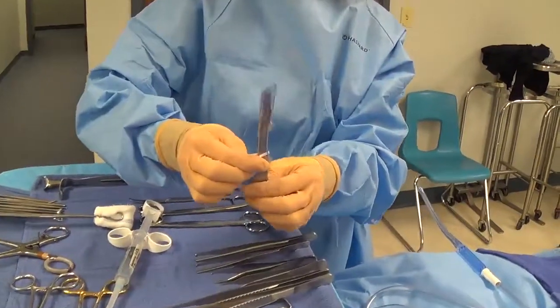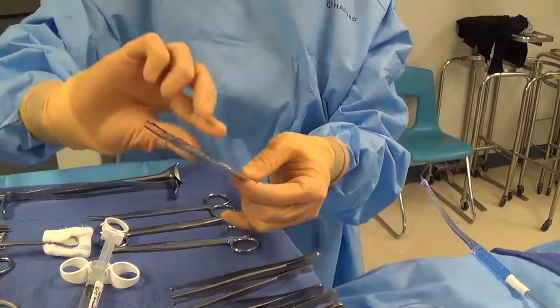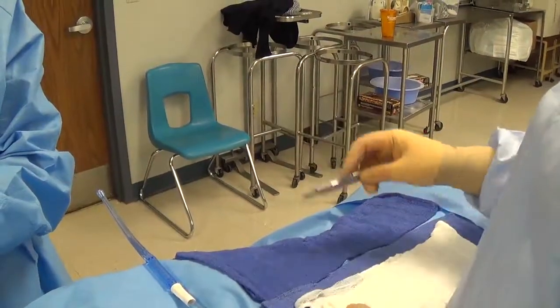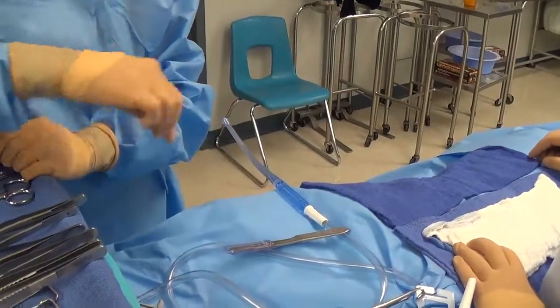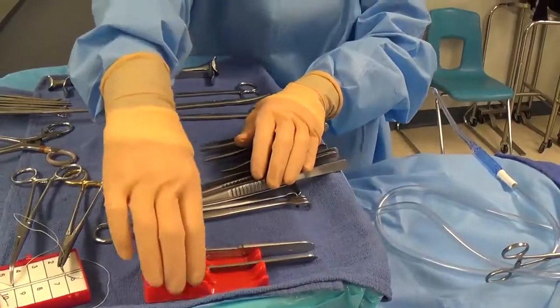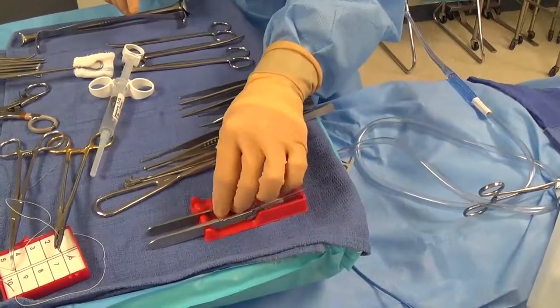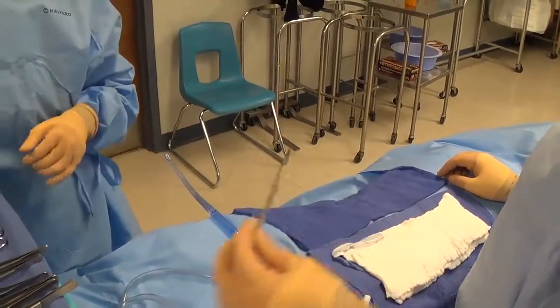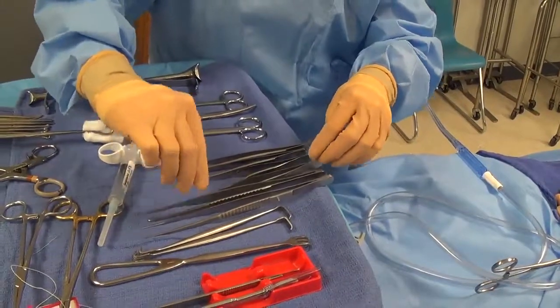If you have a knife with a safety blade, hand it with the safety covering the knife — retracting it defeats the purpose of the safety mechanism. Hand it just like a regular knife and treat it as the sharp that it is even though it's protected. The surgeon retracts the safety mechanism, makes the incision, and should retract and cover it before handing it back. Always assume a sharp is coming back towards you and use the same safety precautions as with a knife without a safety device. Any sharp item is handed pretty much exactly the same way.